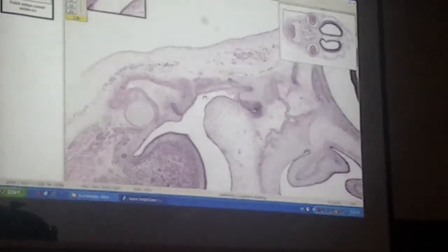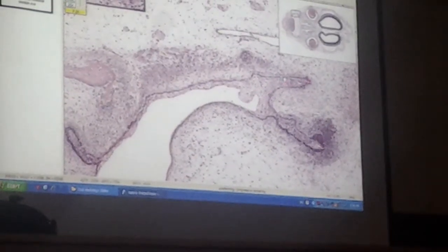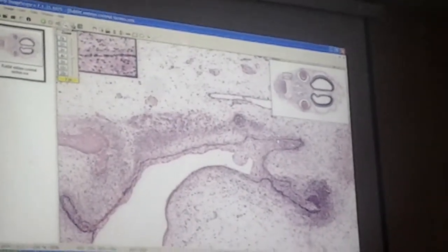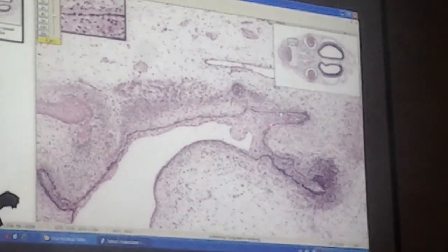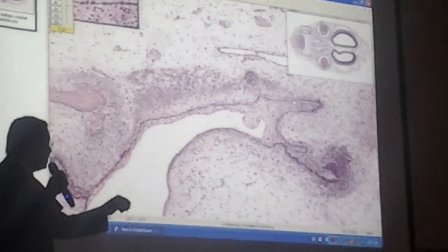Let's move on to the upper jaw. What do we have here? We have the primary epithelial band dividing into the vestibular lamina and the dental lamina. I can show you this slide. Imagine I ask you, is this side buccal or lingual? Buccal, of course. See how the dental lamina has condensation on it. Alright?